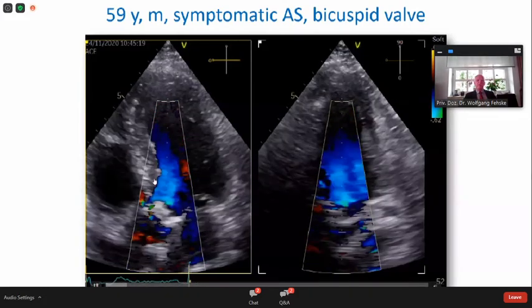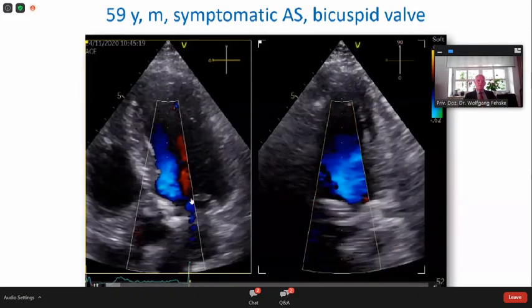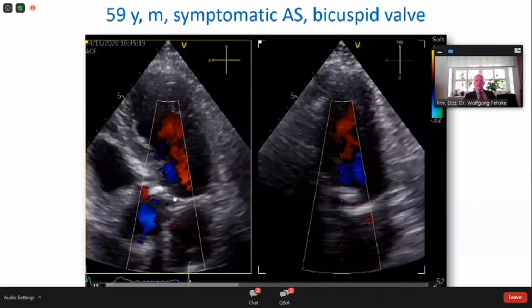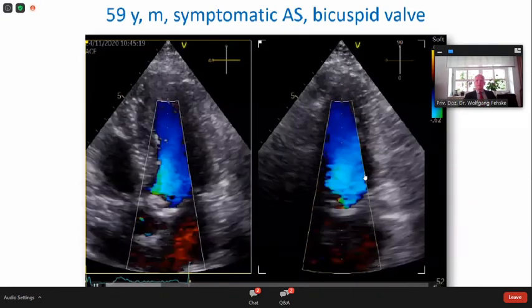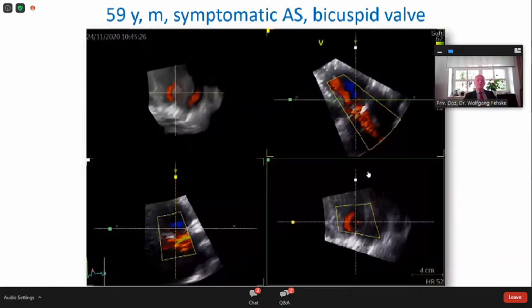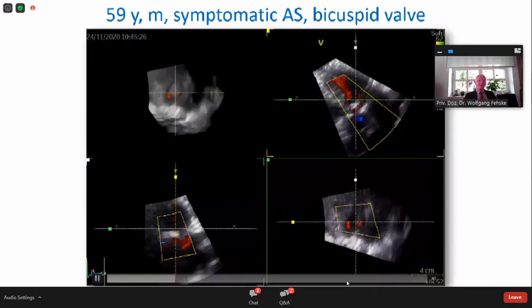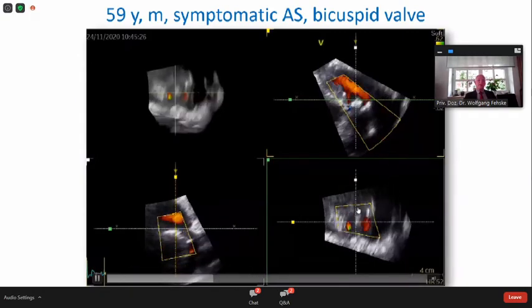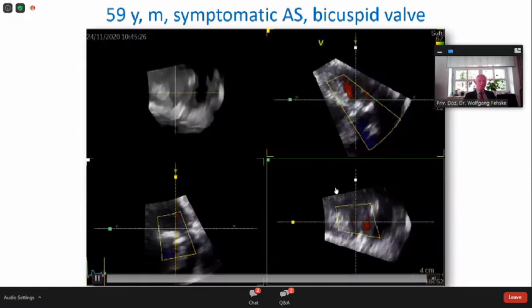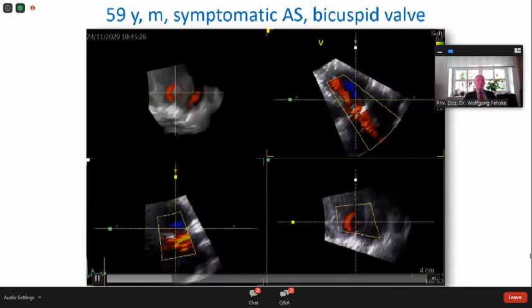You should look for the velocity profile under the valve where you are measuring the velocities afterwards. This can be perfectly done in 3D echocardiography, and it shows that this is first of all an oval-shaped cross area, and you can surely see that it is not at all a homogeneous flat profile.